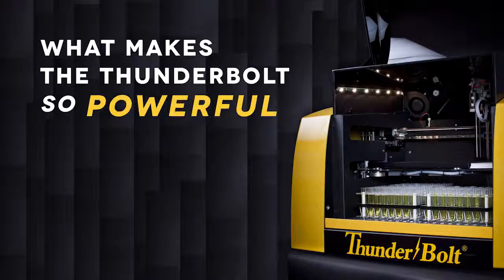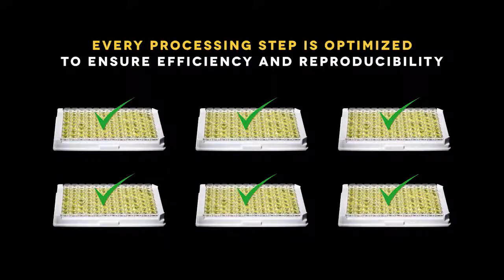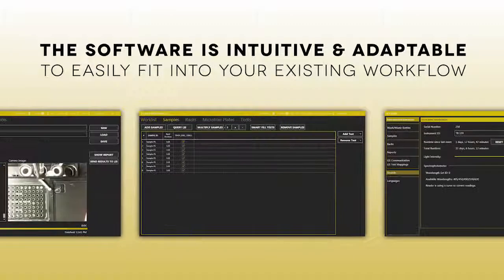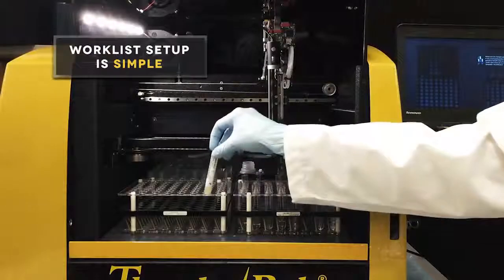What makes the Thunderbolt so powerful? Every processing step is optimized to ensure efficiency and reproducibility. The software is intuitive and adaptable to easily fit into your existing workflow. Worklist setup is simple.